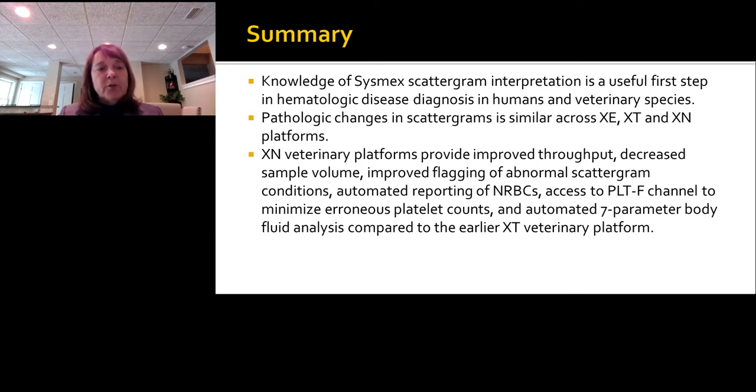You know, if you're doing a research study, it's also important that you could set your gate. And then you always know that it's exactly where it's going to be. And the last example I should give in the veterinary world is you may not know the species you're going to deal with today versus the species you deal with tomorrow. So being able to set up your own, you can go past the normal veterinary species that are provided, and you can really analyze anything.